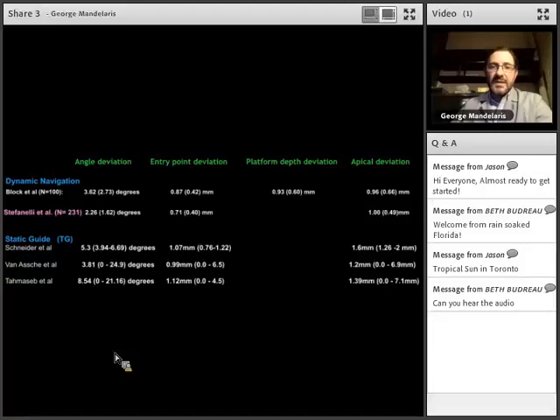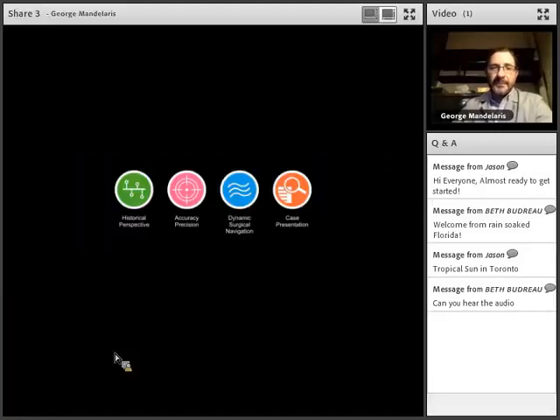So in the aesthetic zone, for me, hands down, this is the way to go. Real-time verification and validation of positional accuracy, that's the trajectory of the profession, that's where we're headed. We'll need more studies to verify and validate, but they're on their way. And this is a really exciting time to be part of the Navident team.